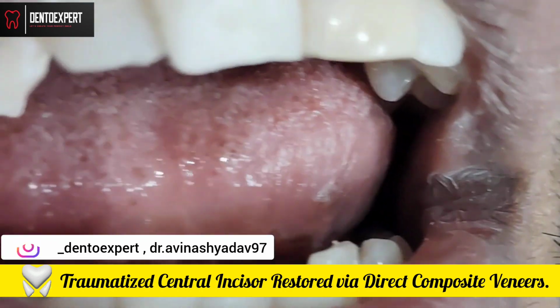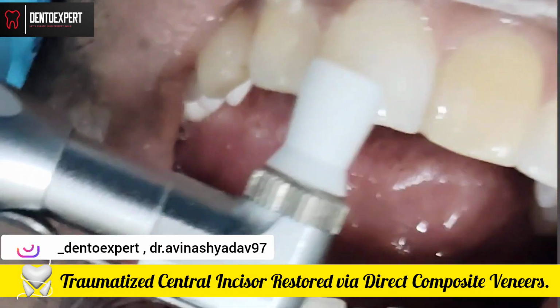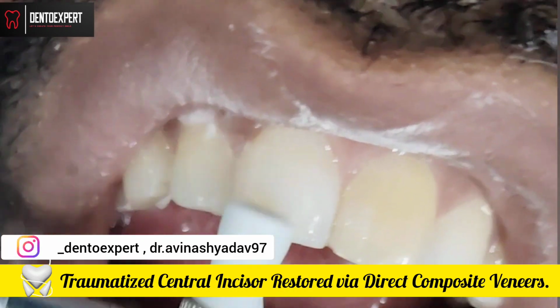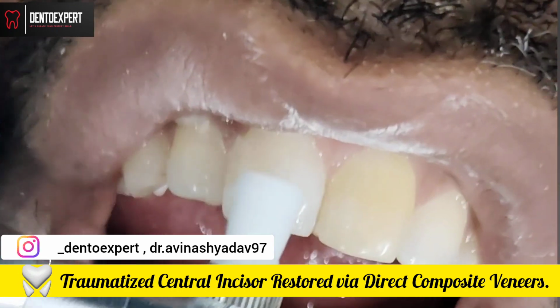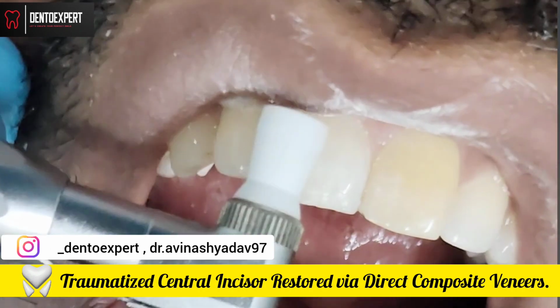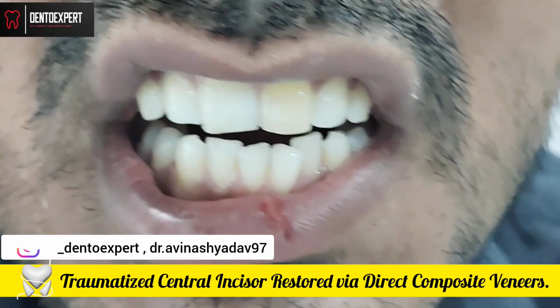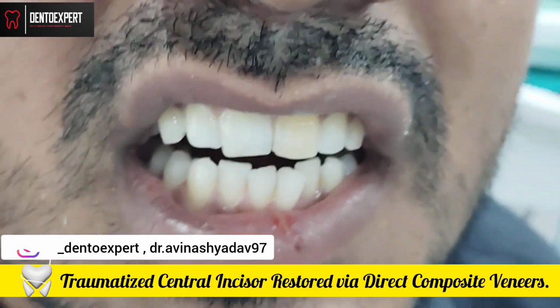Now we will do finishing and polishing by using finishing cups and a finishing brush. Look, this is the fully restored, finished and polished central incisor. Now have a look at the finally restored central incisor and the smile of the patient regained.